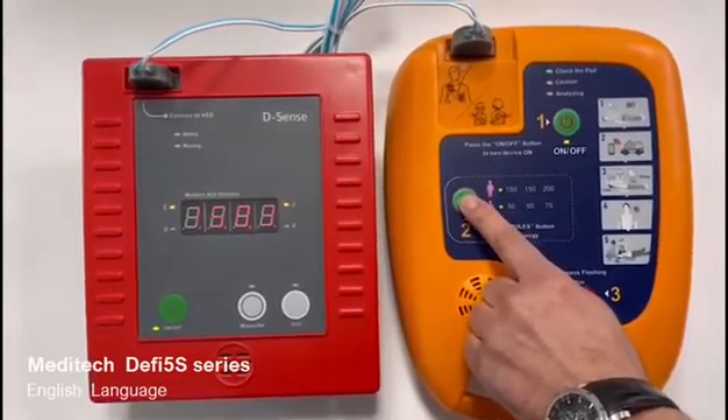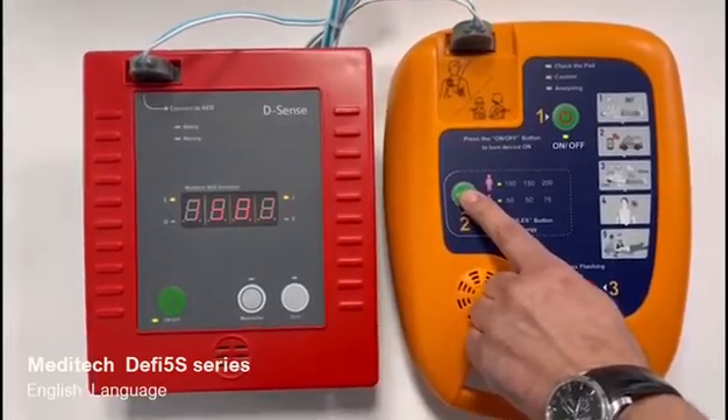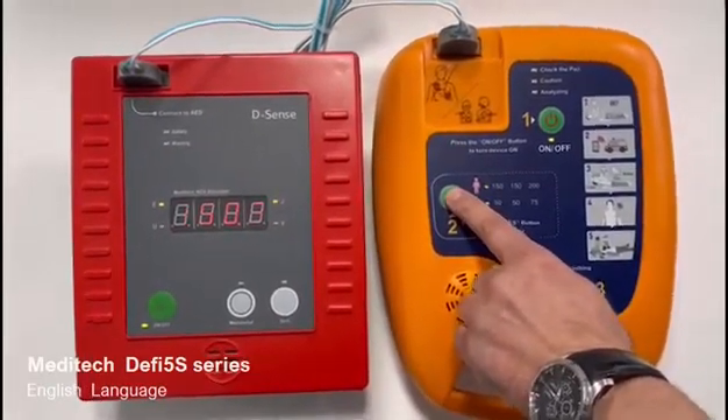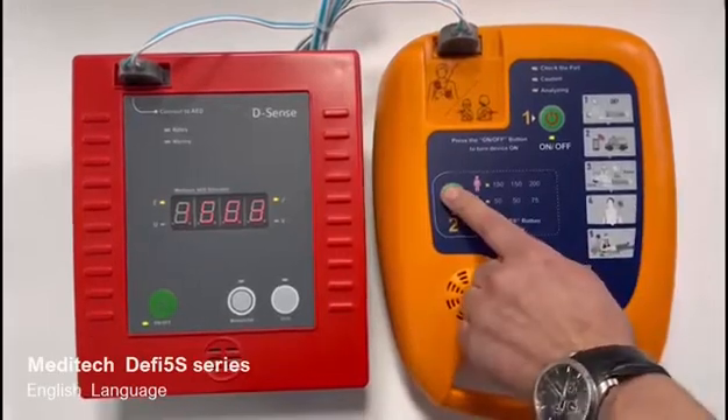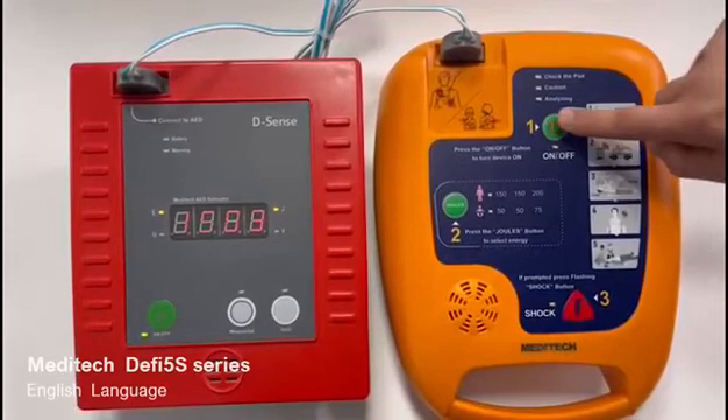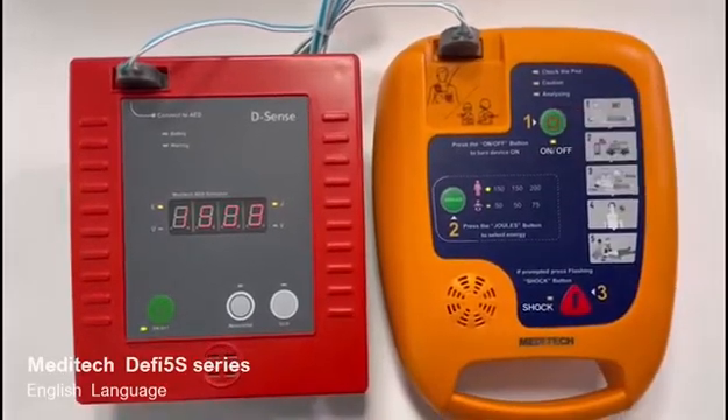Sistema en funcionamiento. System OK. Sistema en funcionamiento. System OK. Sistema en funcionamiento. Sistema en funcionamiento.